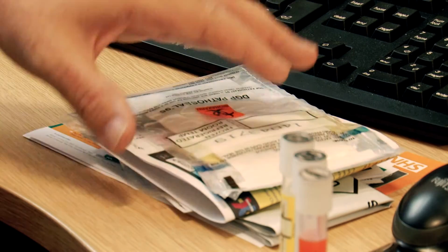Now if it's for your throat, inside your mouth to the back of your throat, keep your tongue out the way. Swab around, back in the bottle, snap off, lid on tight. If it's rectal, then inside the rectum, not too far, swab around, back in the bottle, as before, snap off, lid on tight. So once you've done this, get your envelope, which has got your absorbent material, and then you put your test inside this, and then if it should leak through the post, this will absorb it.